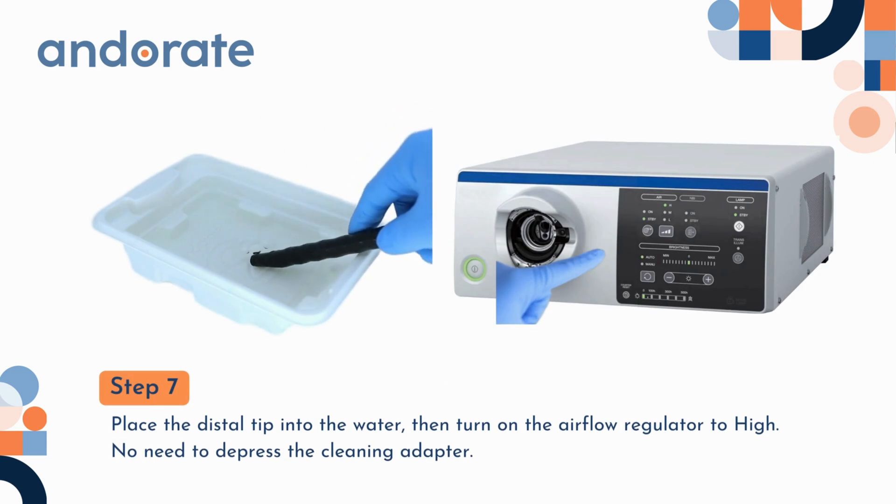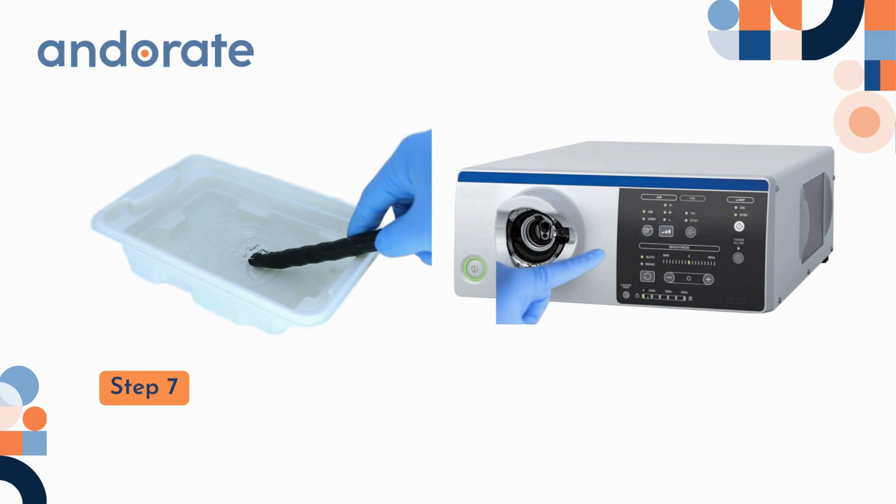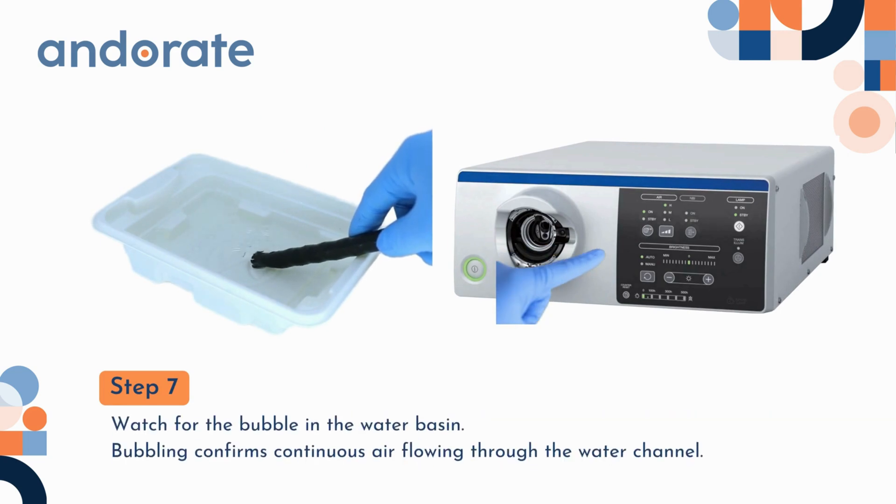Step 7. Place the distal tip into the water, then turn on the airflow regulator to high. No need to depress the cleaning adapter. Watch for the bubble in the water basin — bubbling confirms continuous air flowing through the water channel.